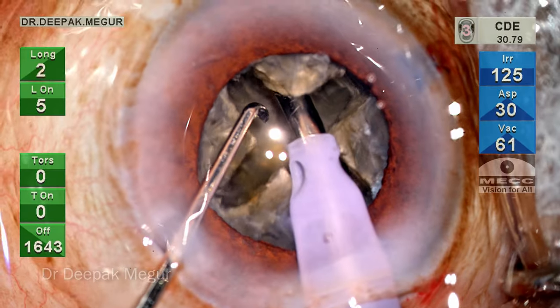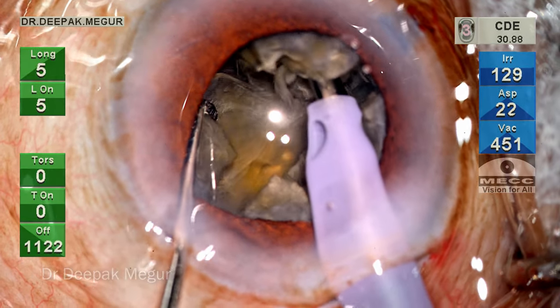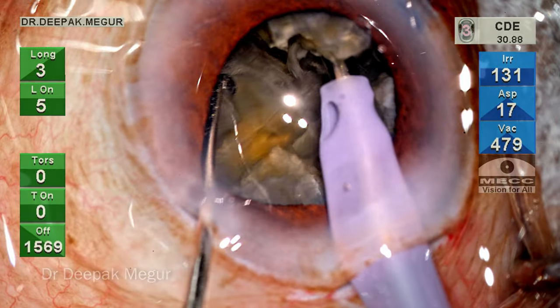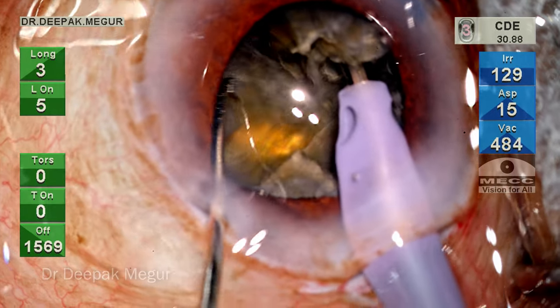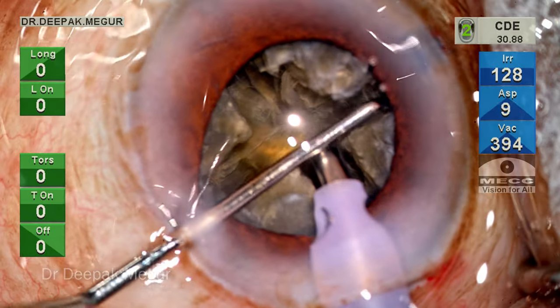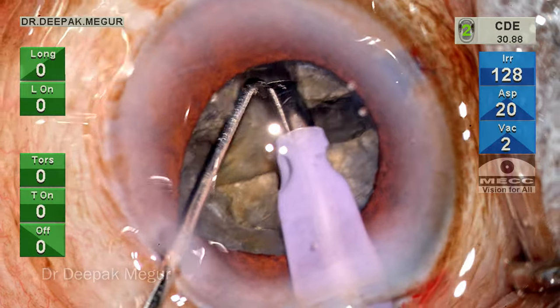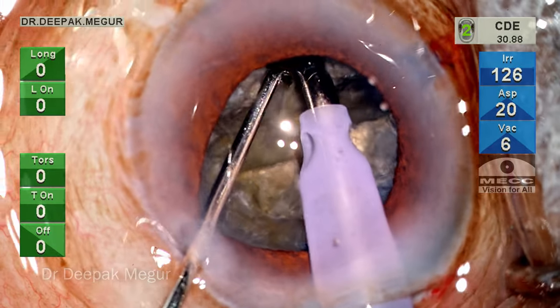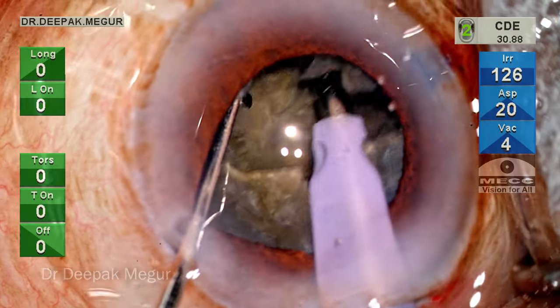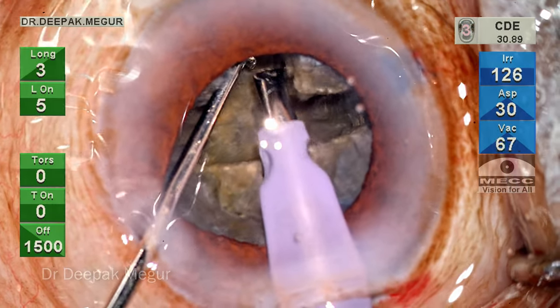I proceed to do the lateral separation without realizing that the central posterior plate is still not shaved deep enough. As expected, there is only a separation of the posterior plate in the peripheral part, but in the central part I am unable to proceed. I rotate the nucleus and try the same lateral separation maneuvers — the result is the same. The peripheral part breaks up while the central attachment continues to be there.